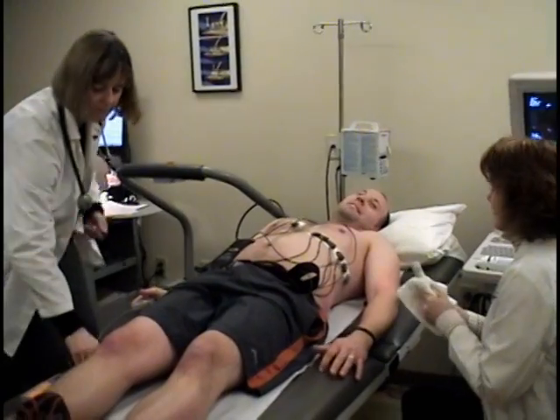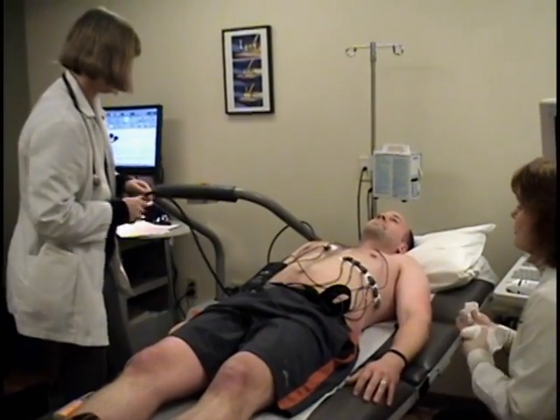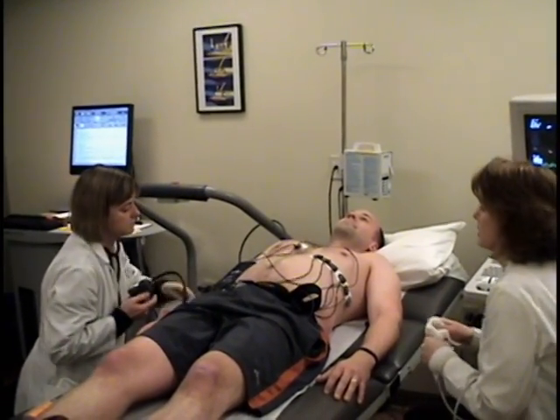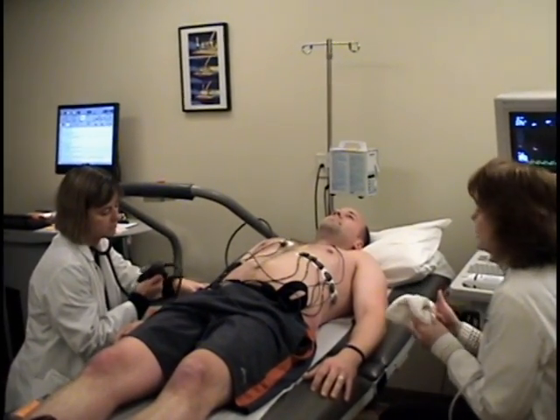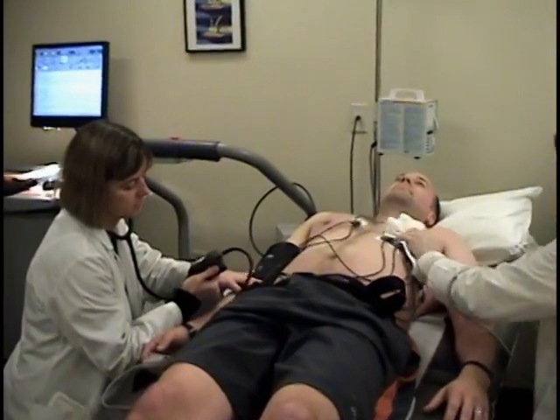If you are an established patient of UCVA, your cardiologist will review your results at your follow-up appointment. If you have been sent to UCVA by your primary care physician, these results have been recorded electronically and will be sent to that physician within 24 to 48 hours.